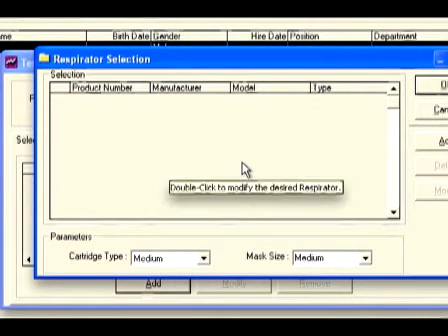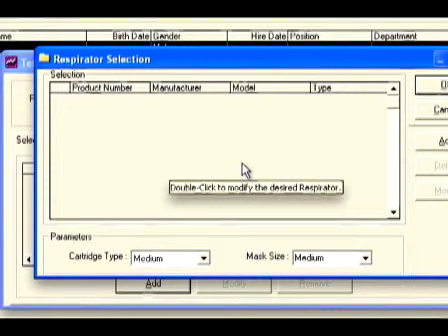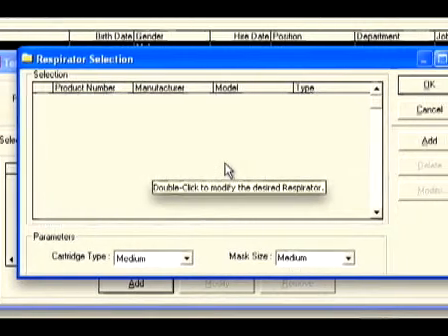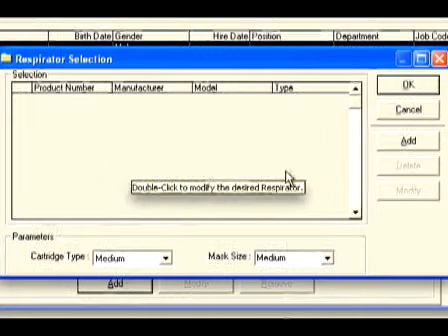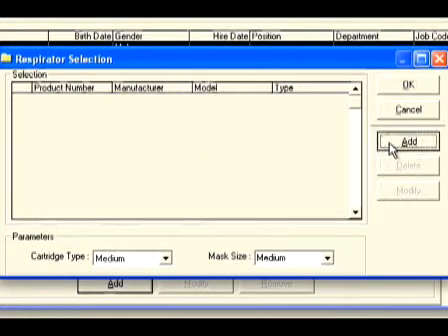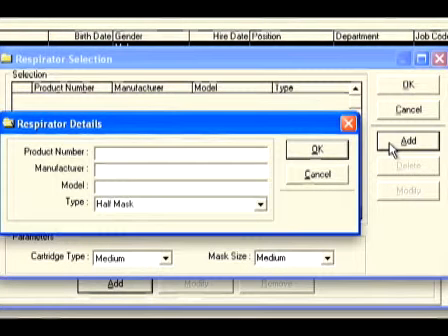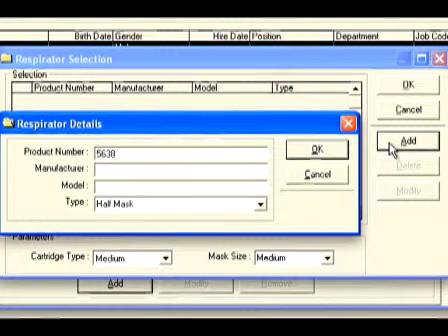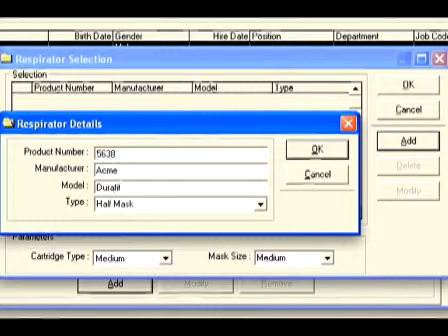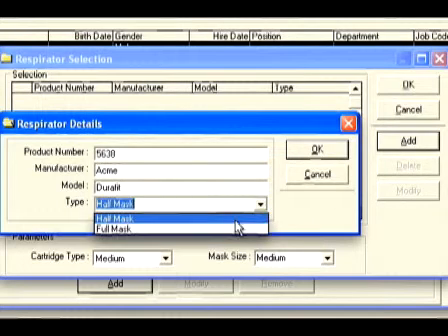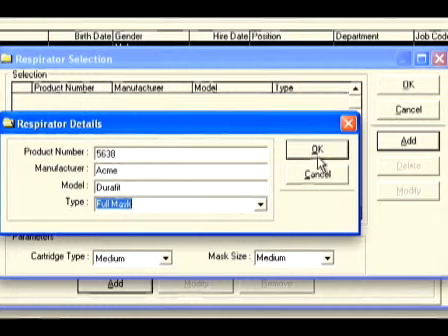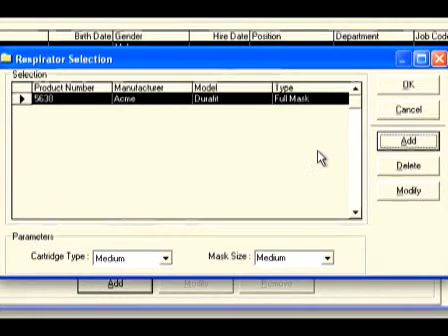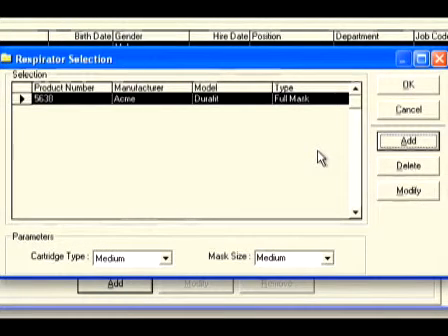The first time you enter this screen, you must add a respirator to your selection list. Click the add button on the right side of the window. Fill in the appropriate information for the respirator you wish to use. If you are using numerous brands of masks, enter each one in this section.